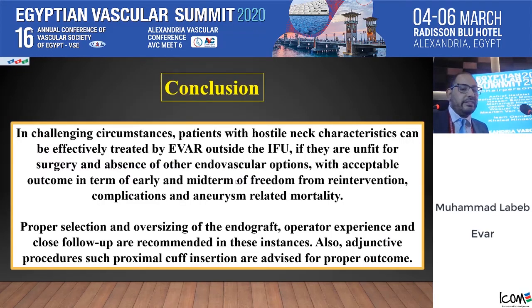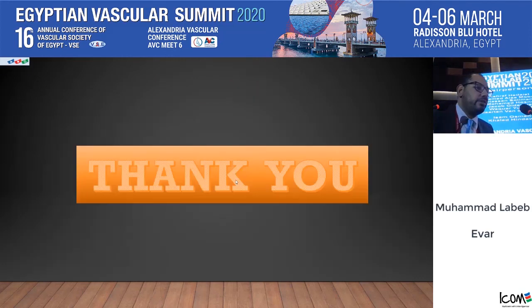So we conclude that in challenging circumstances, patients with hostile neck characteristics can be effectively treated with EVAR, and in these patients proper oversizing, operator experience and close follow-up are recommended. Also, adjunctive maneuvers like proximal cuff insertion are advised for proper outcome. And thank you.